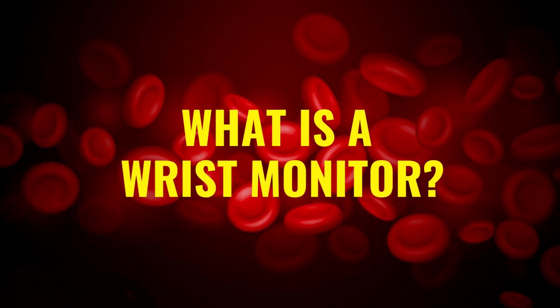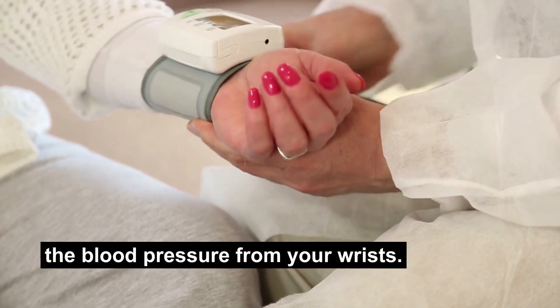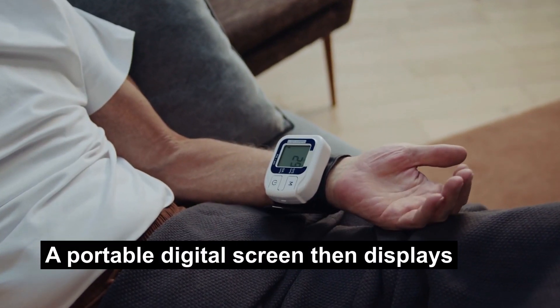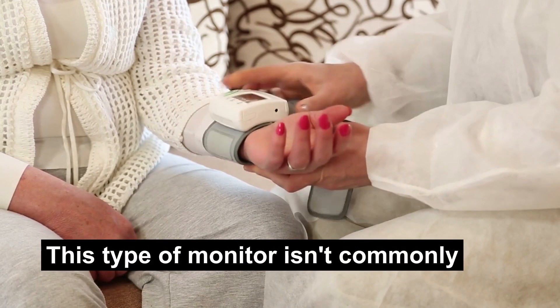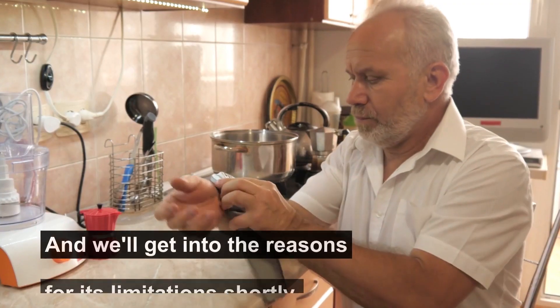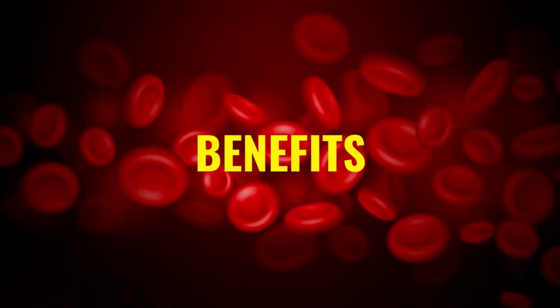What is a wrist monitor? As the name suggests, a wrist monitor measures the blood pressure from your wrist. You need to place the cuff around your wrist instead of your upper arm. A portable digital screen then displays your blood pressure readings. This type of monitor isn't commonly found at the doctor's office, and we'll get into the reasons for its limitations shortly. For now, let's talk about the benefits.